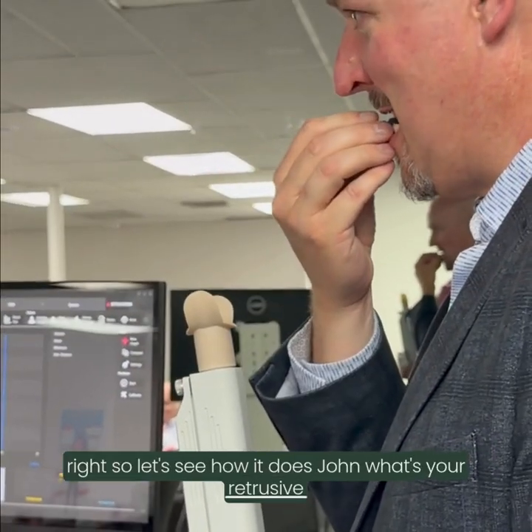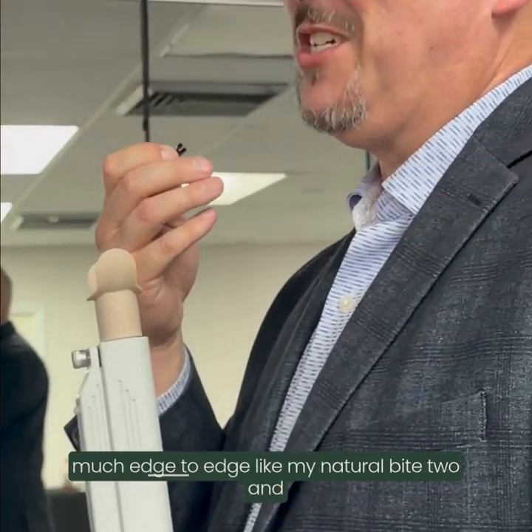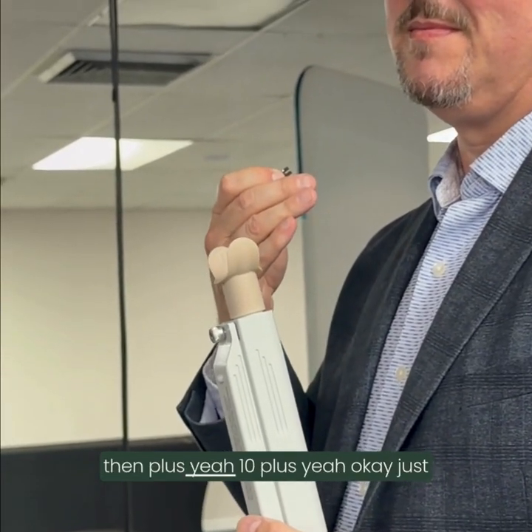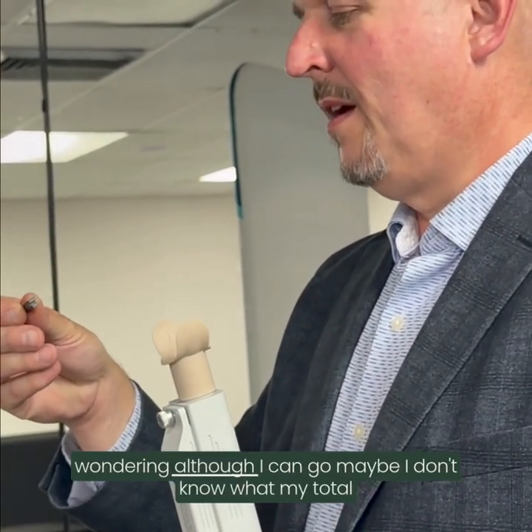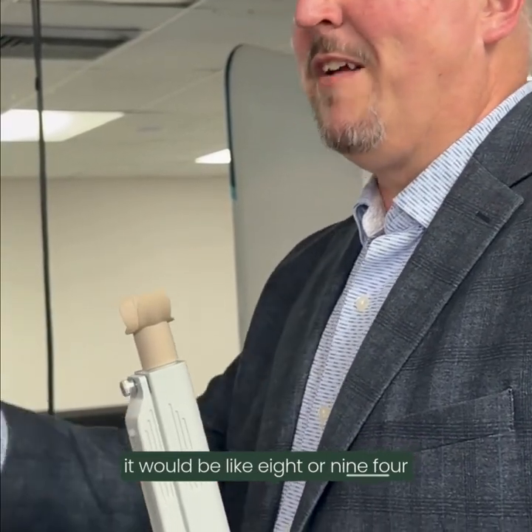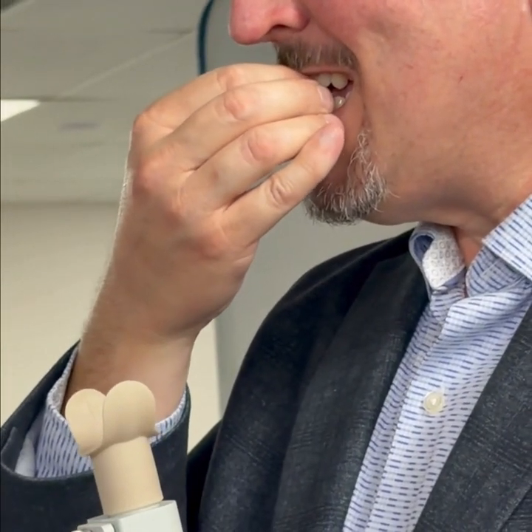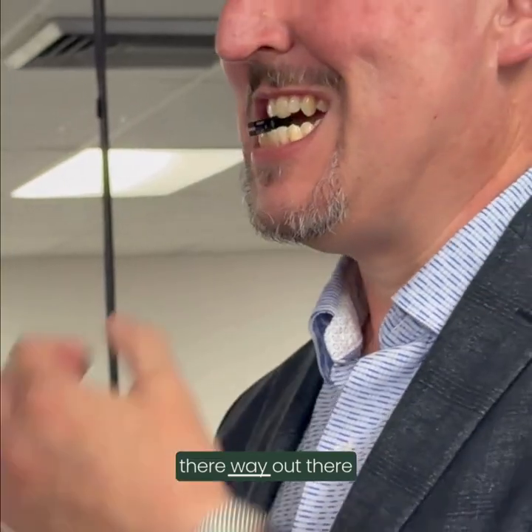John, what's your retrusive to protrusive, by the way? To start, pretty much edge to edge. Yeah, like my natural bite. Minus 2 and then plus 10? Yeah. Okay, just wondering. Although I can go maybe, I don't know what my total would be if I did a George gauge or whatever, maybe 8 or 9 forward, something like that. All right, see that? Way out there. All right.